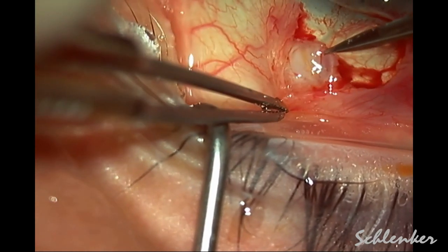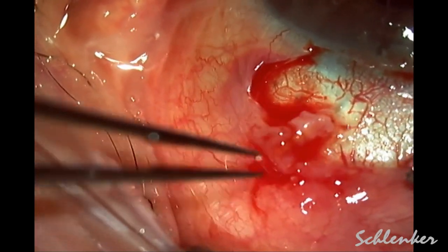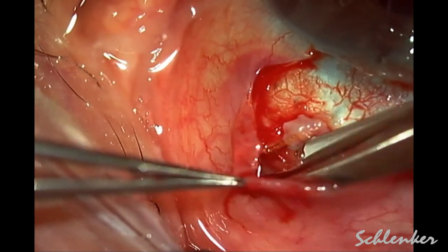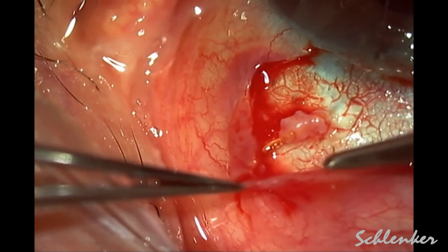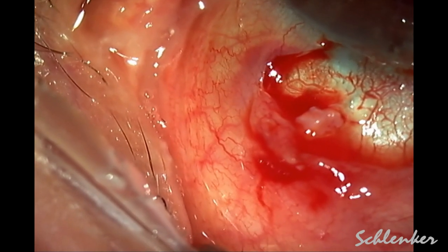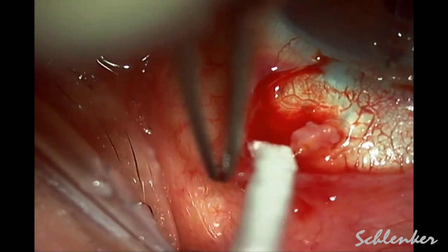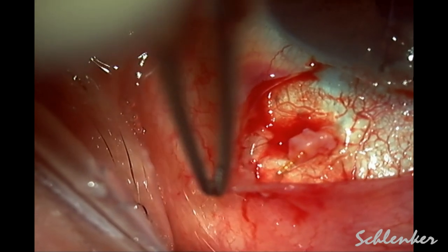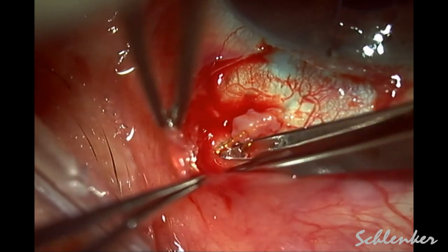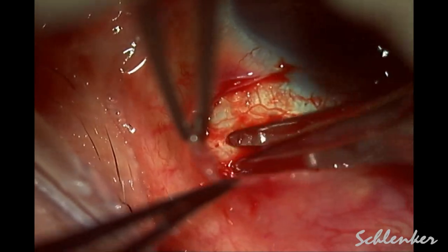You can see here during this dissection we are now slowly exposing the stent — this actually took some time to finally isolate the distal end. It was interesting: immediately we saw flow, little beads of aqueous coming through that Xen micro stent, and this reassured us that we could potentially just clean out all of the scar tissue.